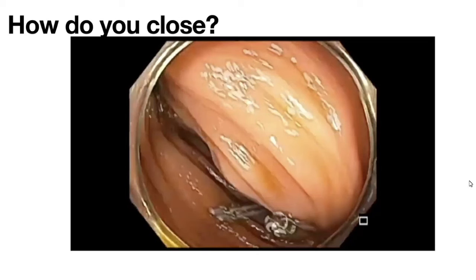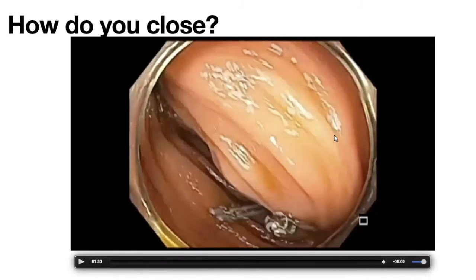The key is when you're thinking about screening colonoscopy, it's a great opportunity for you to prevent colon cancer. And the only way you can prevent colon cancer is to have a clean mucosa, which is free from bubbles, and relatively dry so that you can examine the mucosal vascular pattern and mucosal groove and pit pattern. So get into the habit. It's a very simple thing, but like anything else, unless you make a habit, it's not going to come one day. All right.